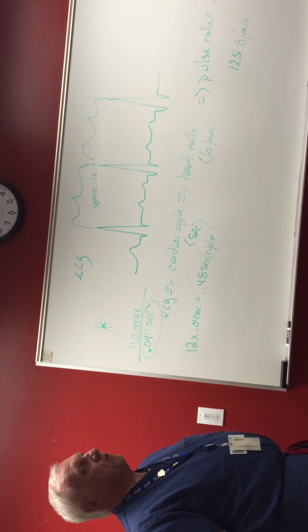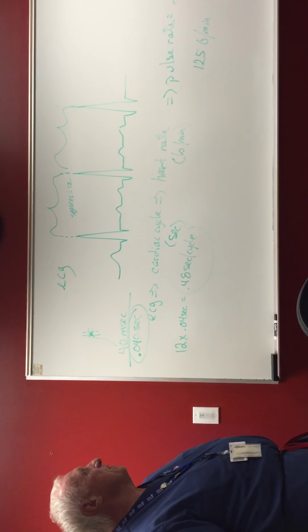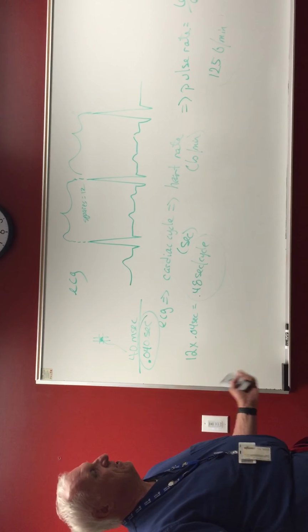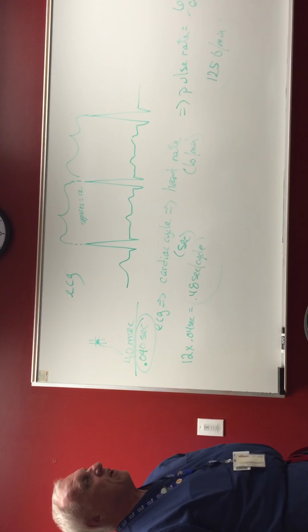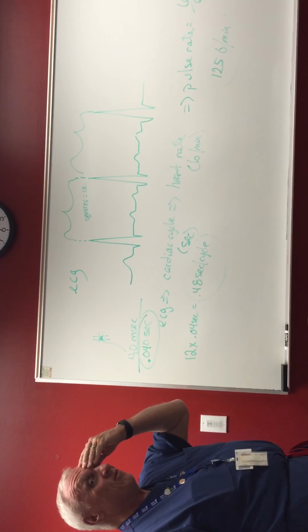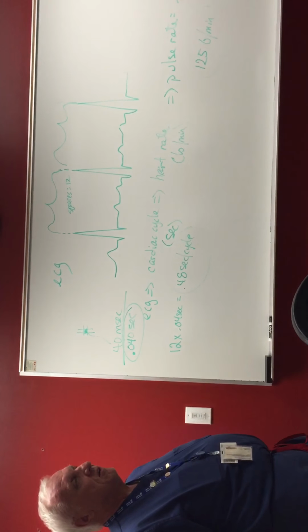But for everything we do with the standard ECG, it's a stupid number, but they're 40 millisecond squares, rather than 25 or 10. It's just the way it mechanically used to be, and we're now stuck with that viewpoint of the world, because the old cardiologists were trained that way and they can't convert. Okay? Thank you. So this is the one that most people had problems on.